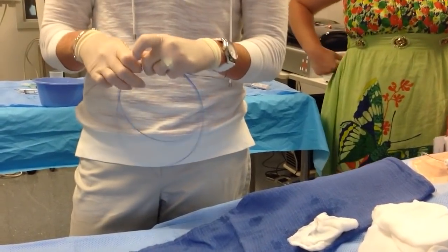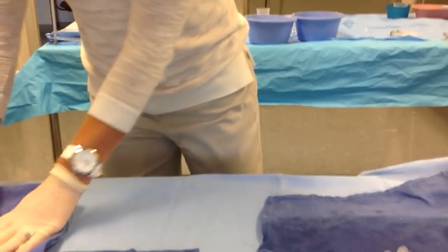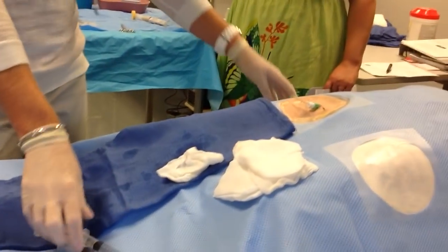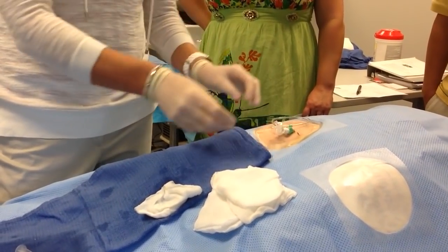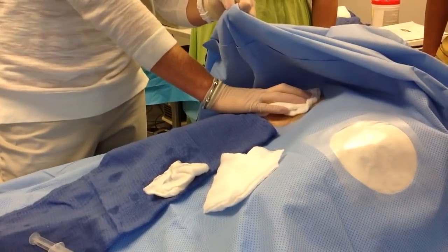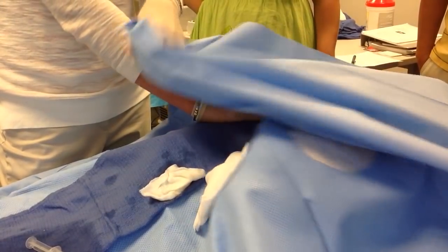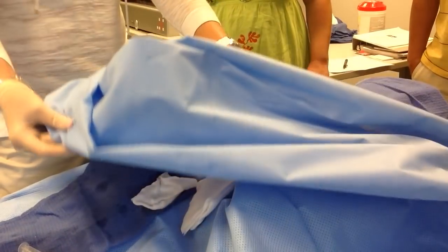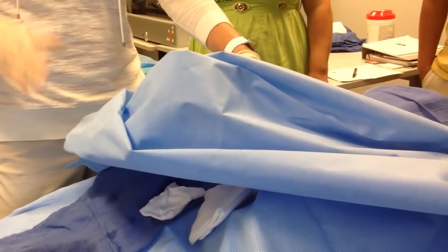And that's it. So then you would clean the area here. And the physician, again, would have been flushing the sheath. They would flush it one last time. I always used to just take this and hook it like that. And I would hold on to it while you pull this back so you don't rip it out. So you hold on to it and you tear this off over top. And then you cover the patient up, disconnect them from everything, and take them back out to the holding room.